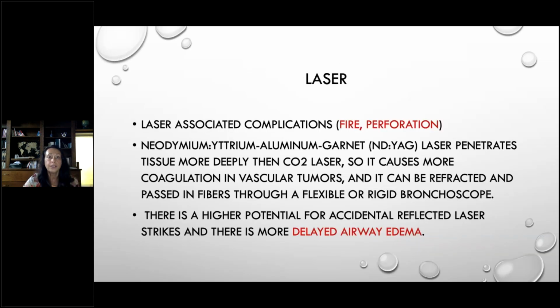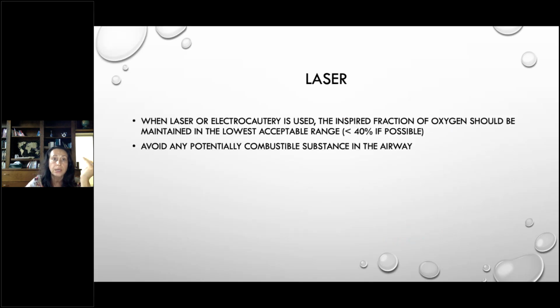Laser. The neodymium yttrium aluminum garnet laser, Nd:YAG laser, can penetrate tissue more deeply than the CO2 laser. So my earlier slide applies to this statement also. It is used more for coagulation of the vascular tumors, but it is also more frequently reflected and can cause delayed airway edema, which can be noted later when the patient is already extubated.